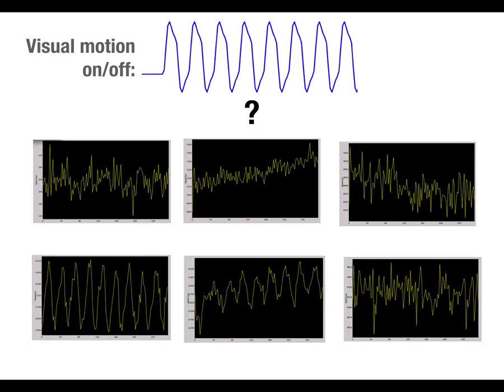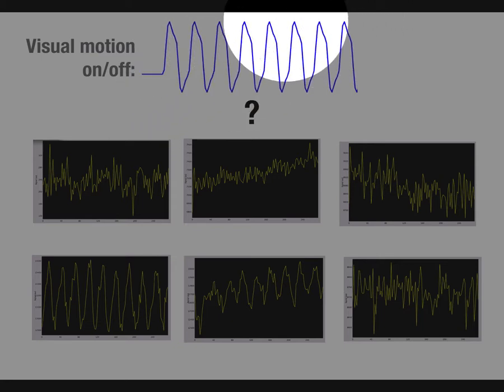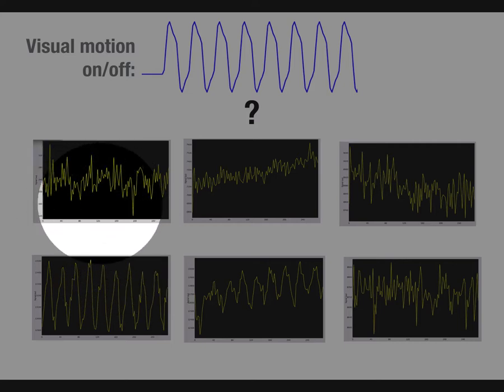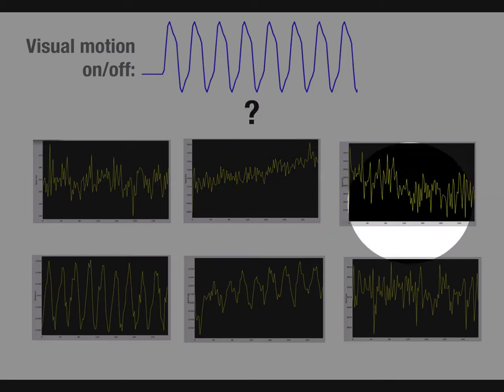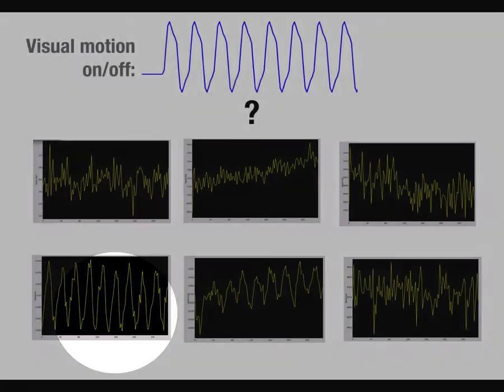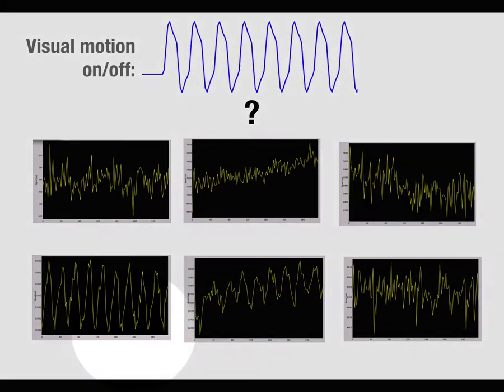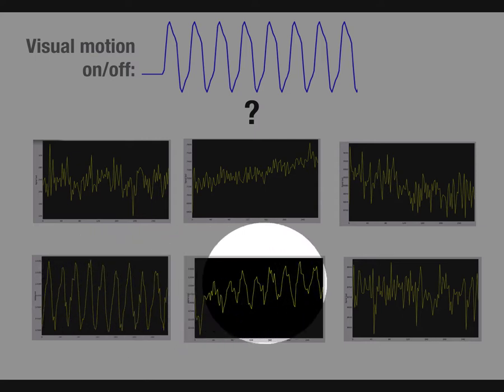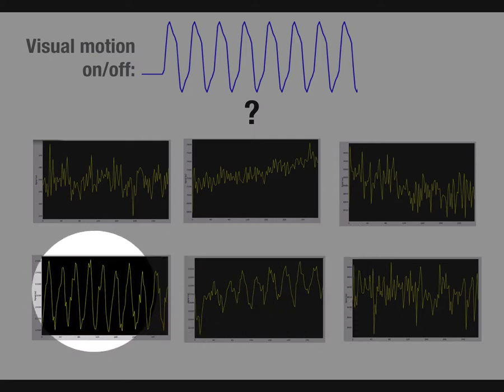And so what you're seeing here at the top is what we call our reference time series, so what we predict brain activation in task-relevant areas to look like. And then down here, we see actual time courses from different individual voxels in an fMRI study in an individual's brain. Some of these don't render super well on the projector, but some of them you can see, like the bottom left and bottom middle, have pretty clear block design kind of patterns to them.